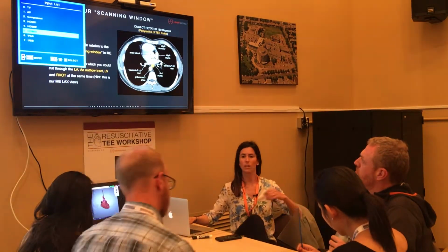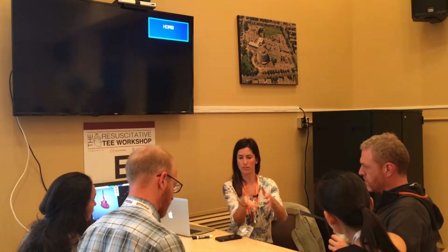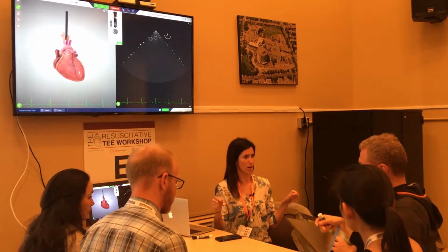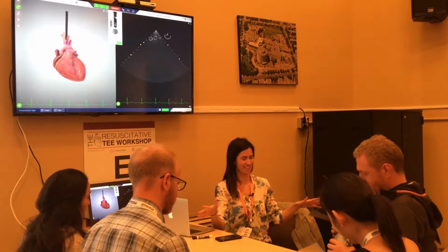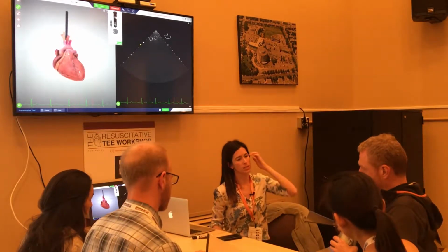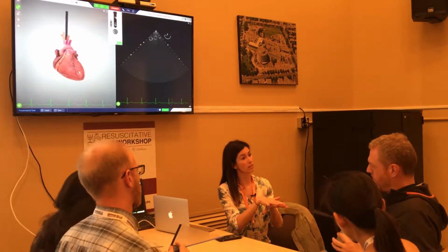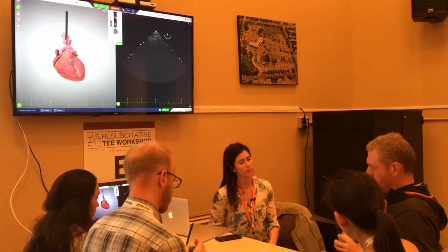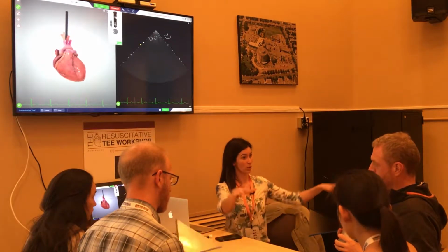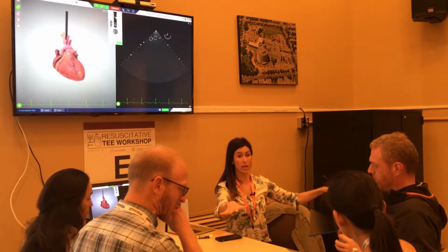All right. So, holding your vector, and just to kind of keep it equal amongst everyone, put your blue side on the right side, your right, because you're the probe, okay? Cool. So I want you to show me, if you were coming down with your vector, what 45 degrees looks like. Show me an omniplane that you changed to 45 degrees. Exactly. So you want to drop that right side. You're moving inferiorly on the right.